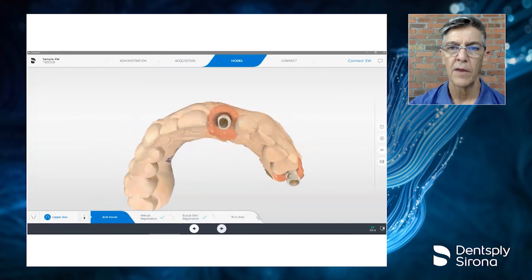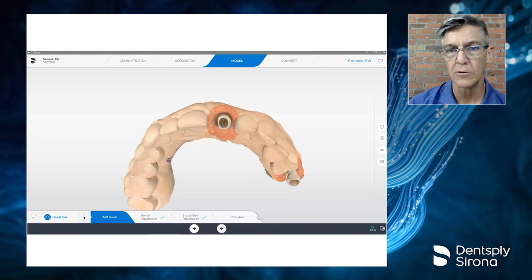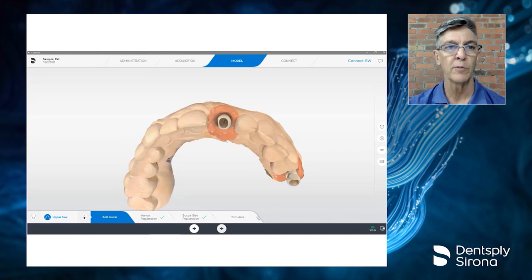the model phase. Now in the model, I will look at this before I upload it, because what I want to look at is the access hole for this particular implant. If I think it's going to be a conflict with the aesthetics or the functional portion of the implant crown, I'm going to make a mental note, because I'm going to tell my laboratory we might want to use an angle screw access correction.